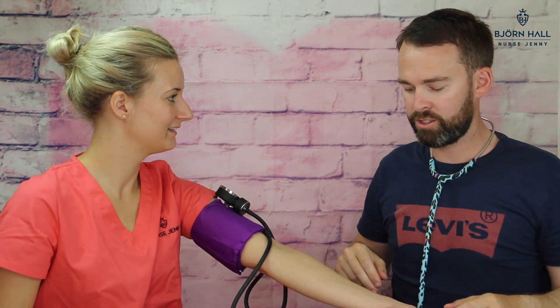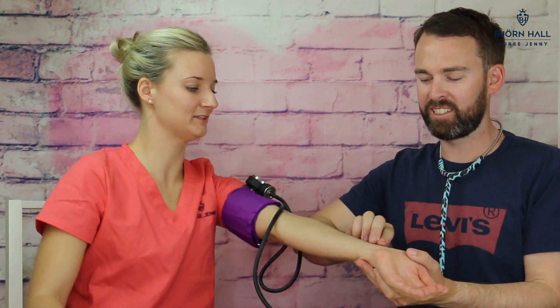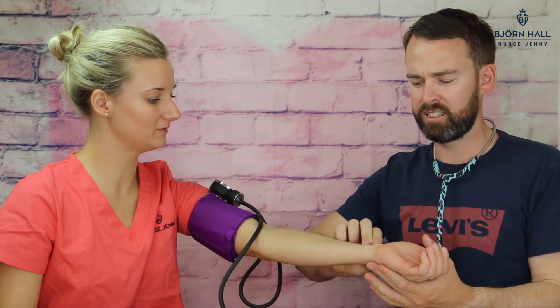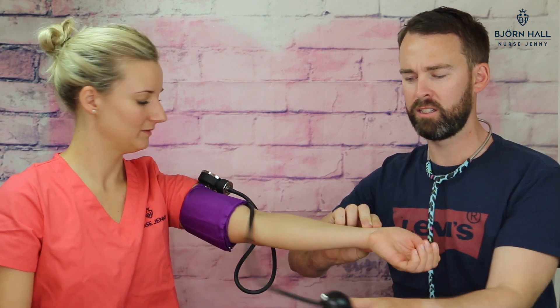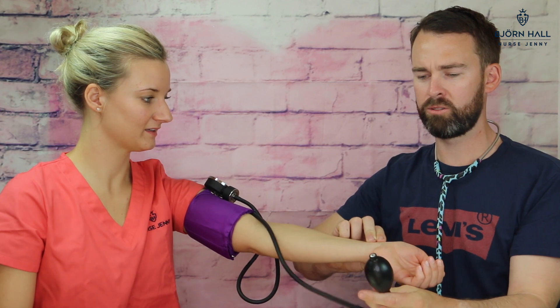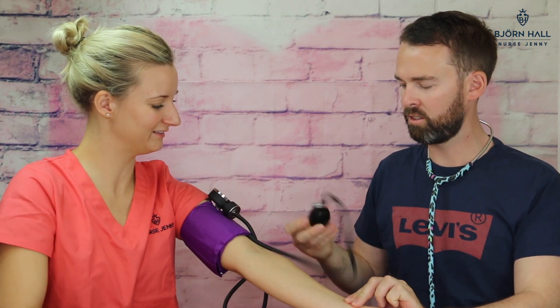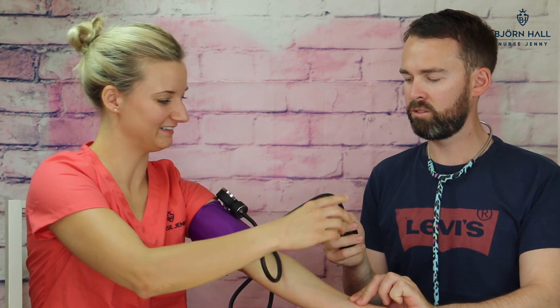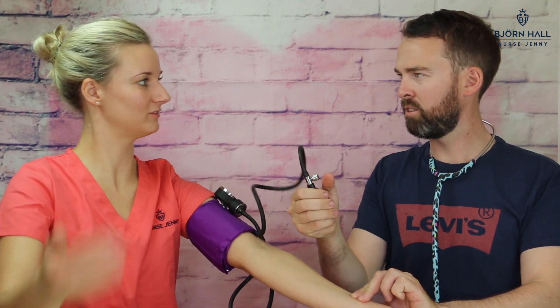So can I just pump it up to 140 and go from there? No — try and estimate my systolic. So feel my radial. That's where it should be. Can you feel it? Yeah. Close towards me. So now do you want to do that with your left hand or your right hand? Right. And you're holding it the wrong way around — turn it around. That's it. Closed.